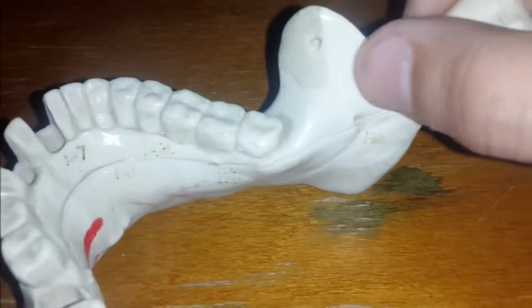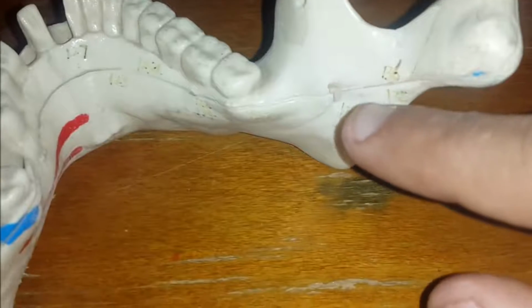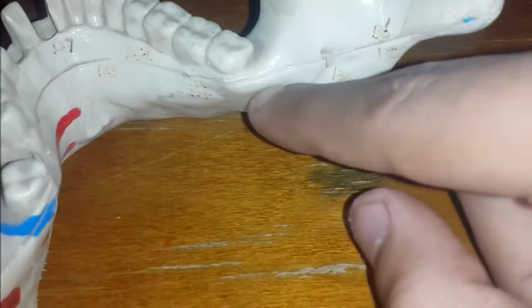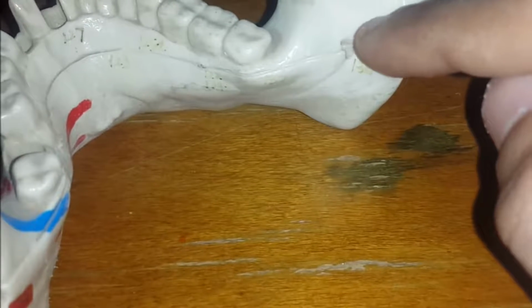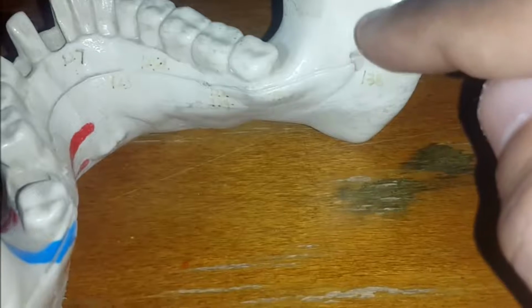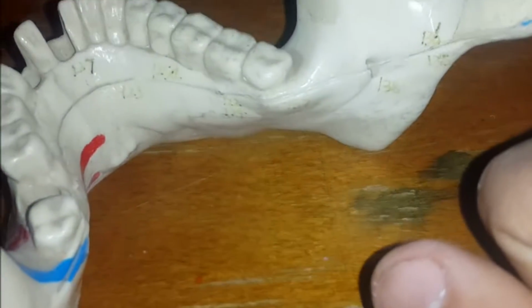As described earlier, the target of the block is to place local anesthetic just above this foramen. This foramen is called the mandibular foramen, and it leads into the mandibular canal. The inferior alveolar nerve enters into this foramen. So by placing the local anesthetic here, just above the mandibular foramen, we ensure that the local anesthetic passes the inferior alveolar nerve as well as the lingual nerve in most cases, as mentioned earlier.